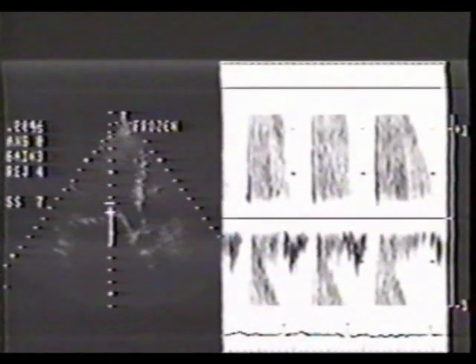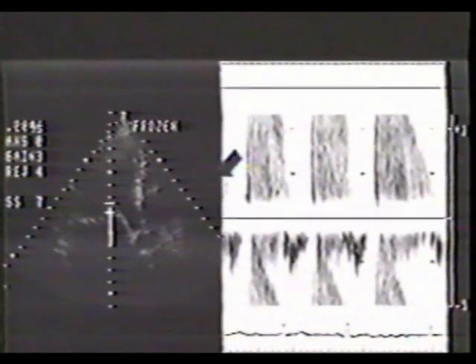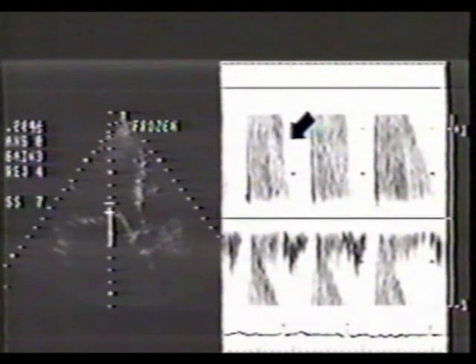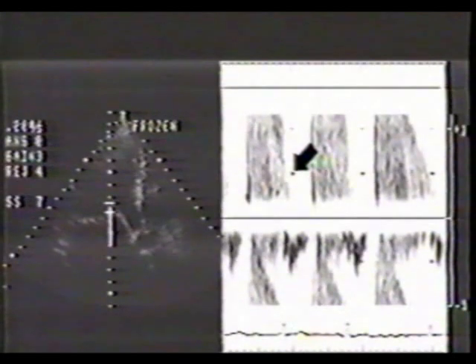This patient has mitral stenosis. We are using a duplex transducer. The Doppler sample volume has been placed on the left ventricular side of the mitral valve to analyze the diastolic jet. This is the resultant pulse Doppler velocity spectrum. The calibration markers are 0.5 meters per second.